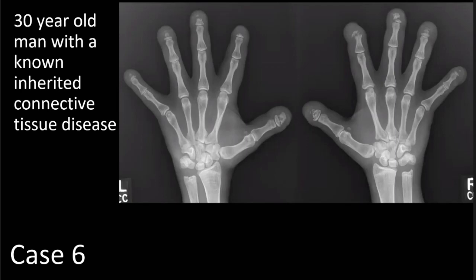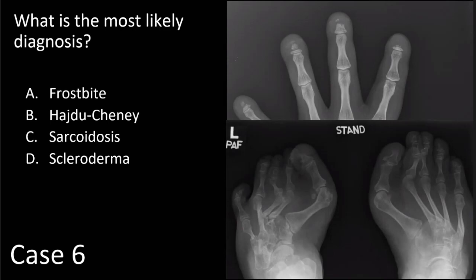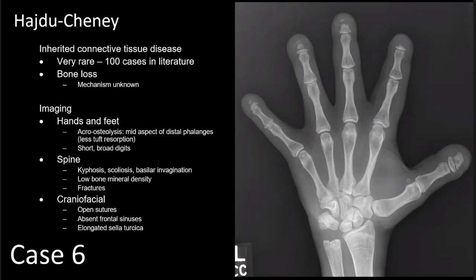Our next case is a 30-year-old man with a known inherited connective tissue disease. On these AP radiographs of both hands, we see acro-osteolysis of the distal phalanges of every finger bilaterally, predominantly centered in the shafts of the distal phalanges with fairly well-defined horizontal clefts of bone loss. We also see that the metacarpals are short relative to the proximal phalanges, the carpi have a squared-off configuration, the distal radioulnar joint spaces are widened, the distal ulnae are mildly deformed, and the fingers are short and broad. In this patient with acro-osteolysis, what is the most likely diagnosis? This is one of those extremely rare entities — Hajdu-Cheney syndrome.